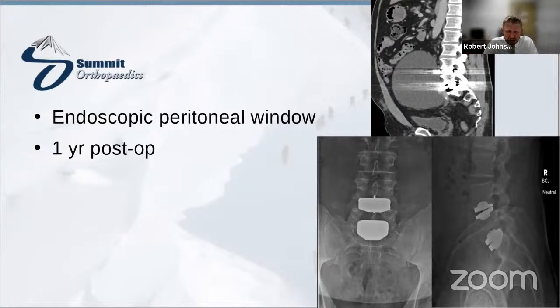Sometimes your access surgeons will say, oh, that rent's not that big, I'm not going to sew it up, I'm not going to worry about it. So we're literally cutting out a box so that it just drains right in there, and then it absorbs, and it's actually pretty seamless. It's a pretty good size. We're talking probably 3 to 4 centimeters by 3 to 4 centimeters.